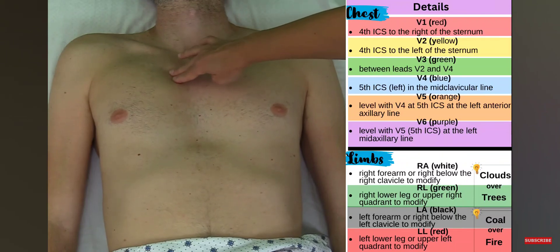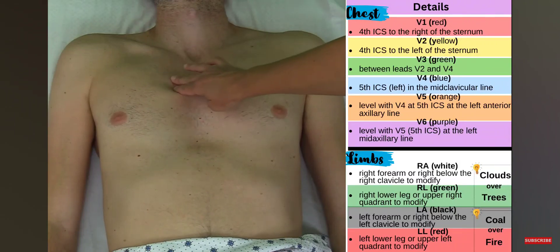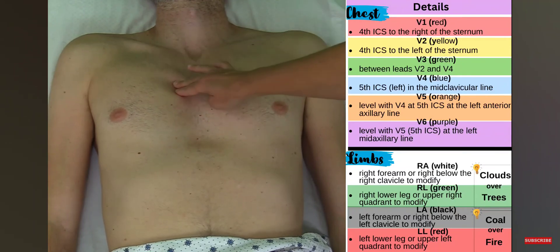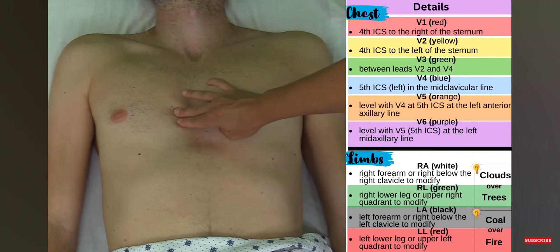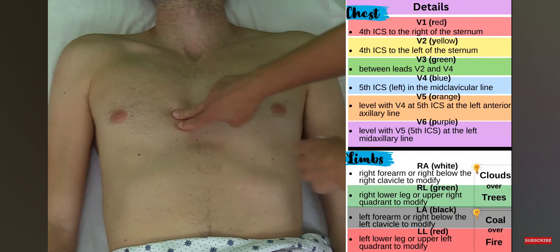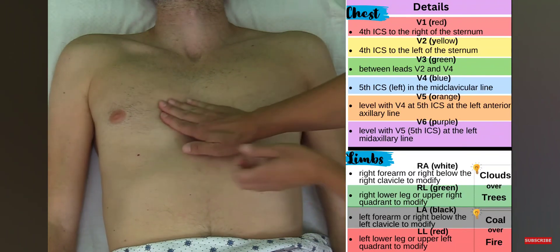Using the angle of Lewis, I go to the right and feel something hard — that's the second rib. I slide my hand down a little into a space where I don't feel anything hard, meaning I'm in the second intercostal space. Sliding a little more, I go over a bone and feel the third intercostal space, then just a bit more for the fourth intercostal space. This is just right of the sternum — not on the sternum — and this is where V1 goes.